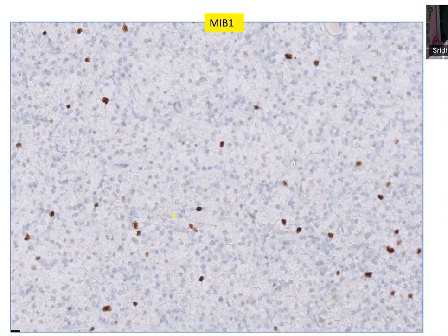And this is what? MIB1, Ki-67 or MIB1. You see the labeling. For this MIB1, you are not supposed to interpret only the strong intensity. You are supposed to interpret any labeled cell. Intensity does not matter for MIB1; it is the labeling that matters.